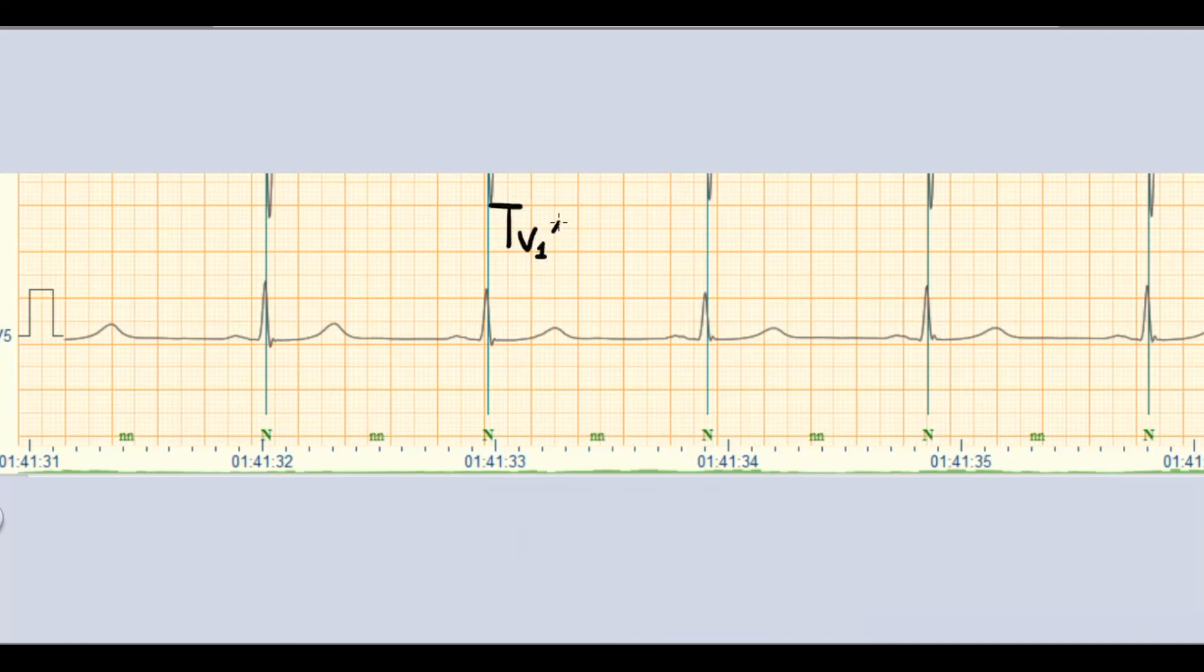As a result, T wave should increase in amplitude from V1 to V4. T wave in V5 and V6 should be less than T wave in V4.